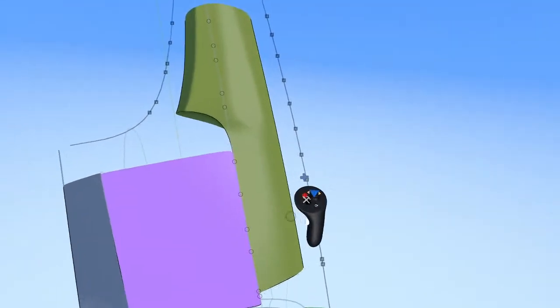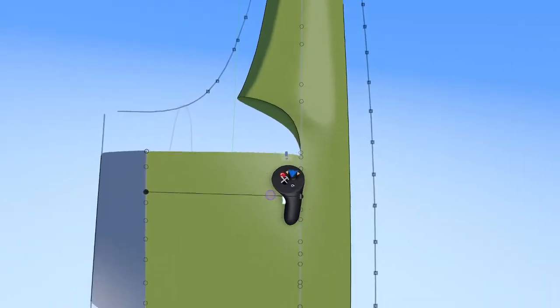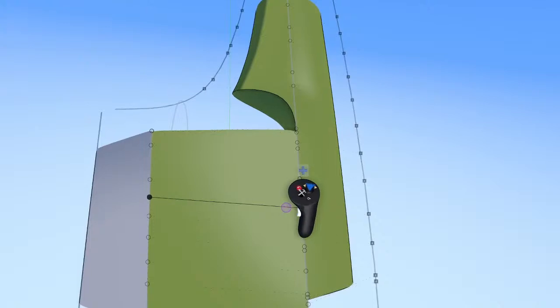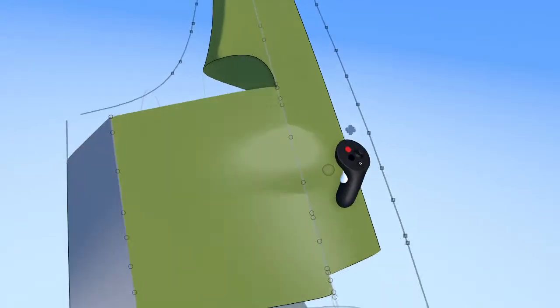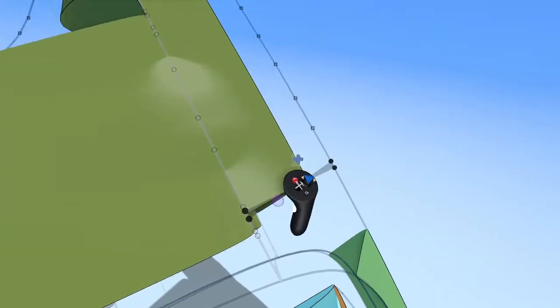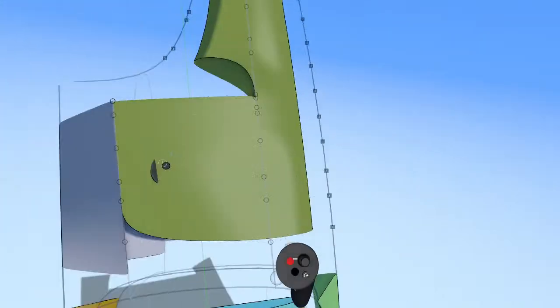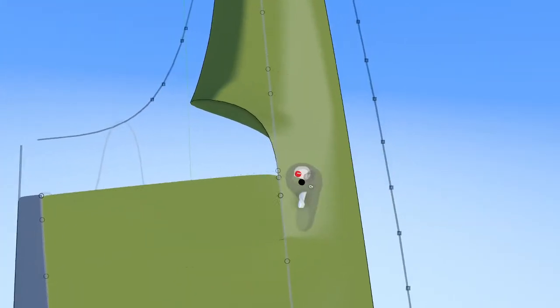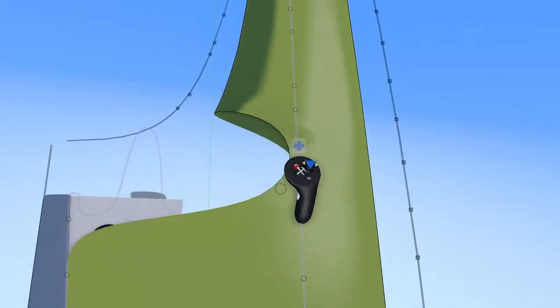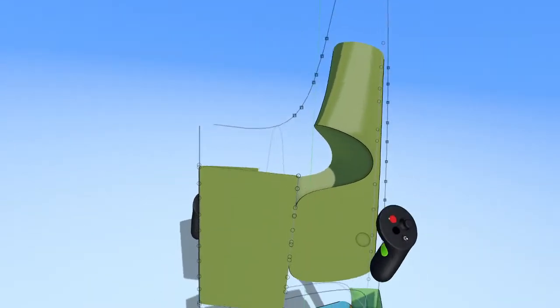All right. So now let's go back to the merge tool and start merging these other surfaces together. All right, we have some extra edit points up here. That's all right, we'll delete them. Merge this guy over here.